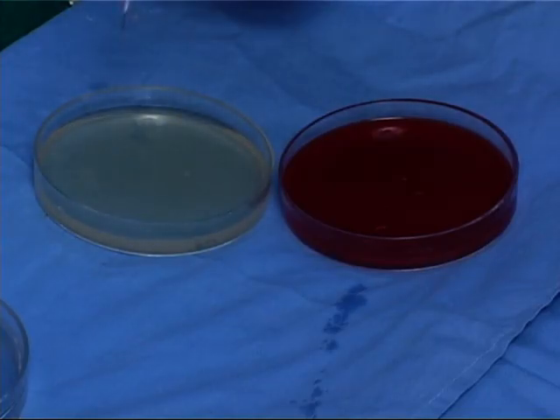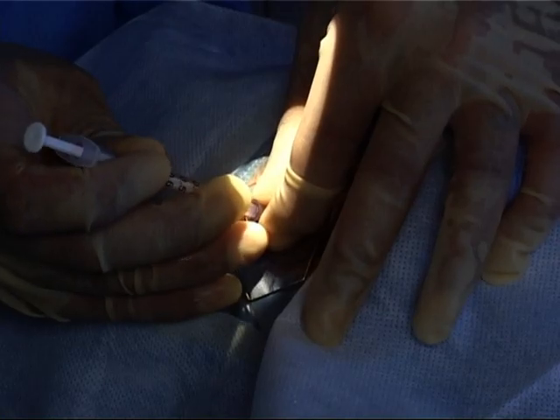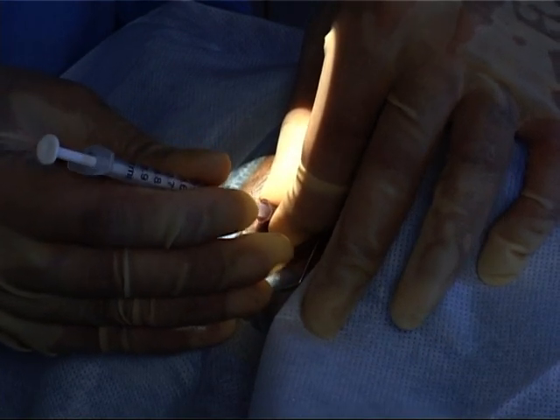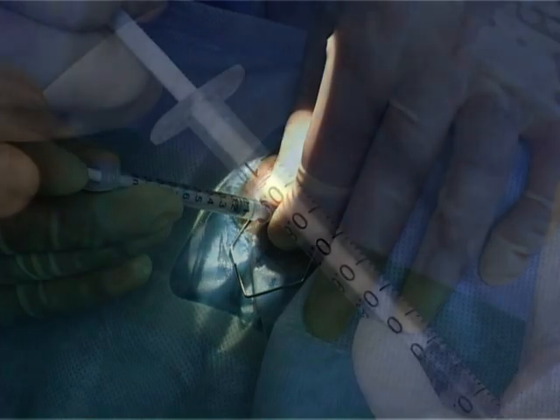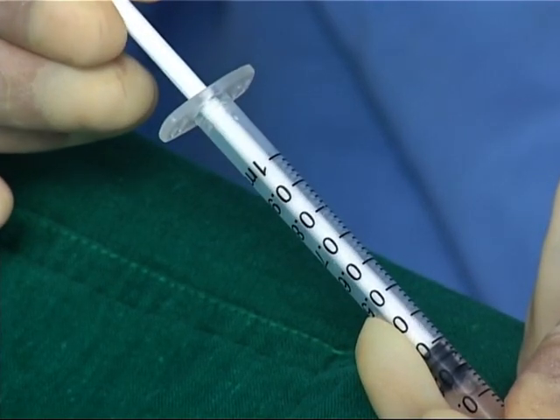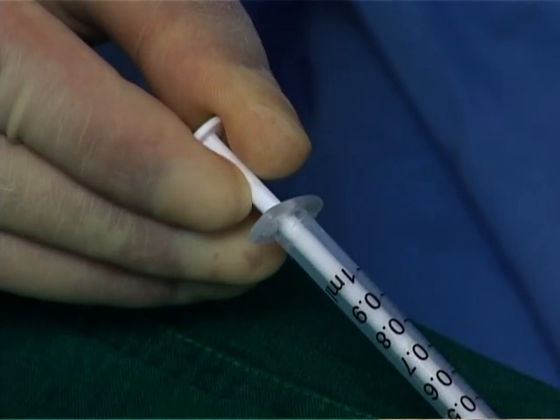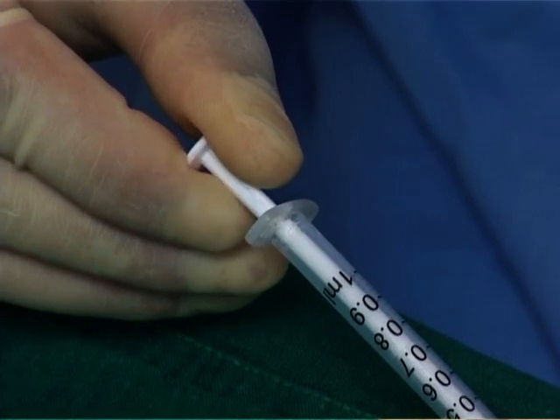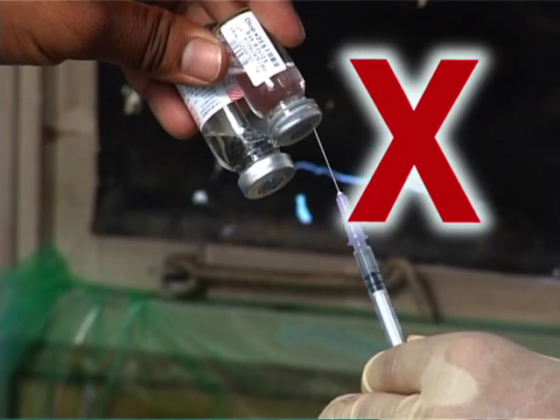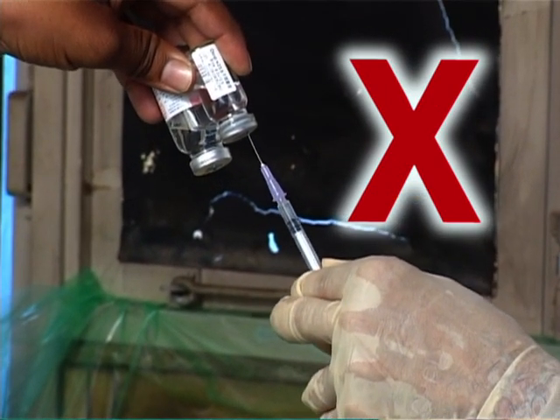Change the syringe to the one with the drug without withdrawing the needle from the vitreous cavity, and inject exactly 0.1 ml of medicine slowly in a drop-by-drop manner, avoiding jet formation, which is achieved by rotating the plunger. Use a separate syringe and a second injection site for a second drug if the two drugs cannot be combined.